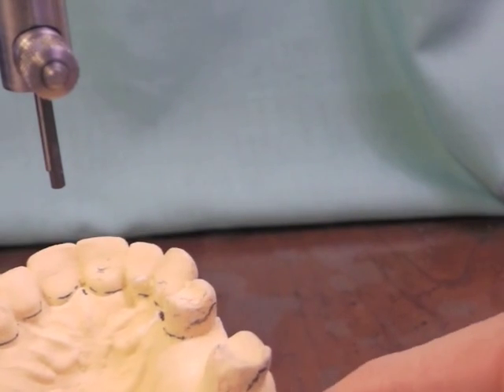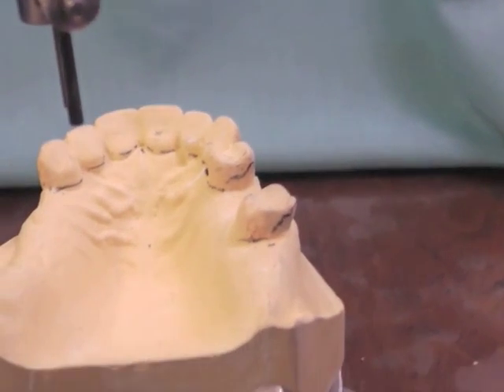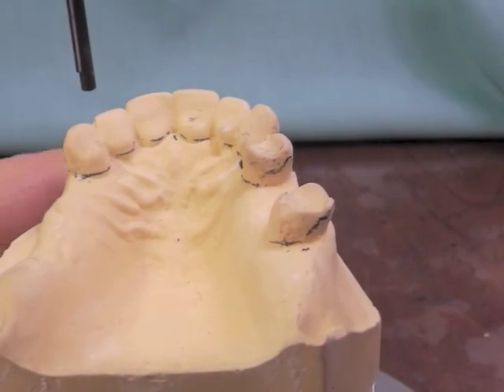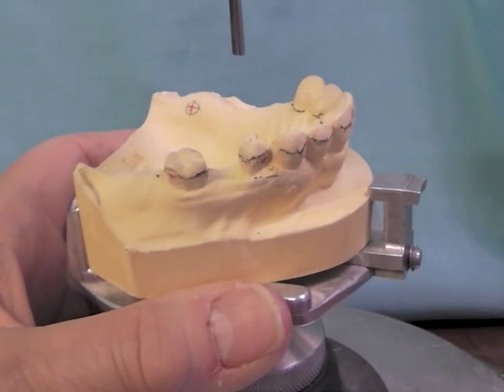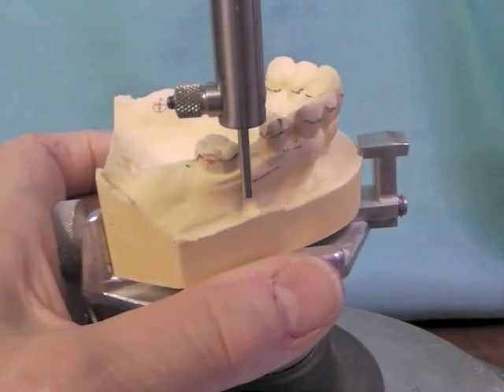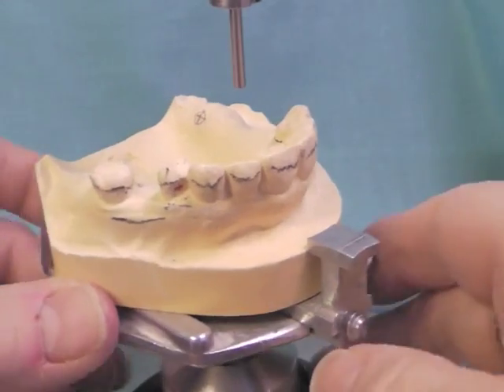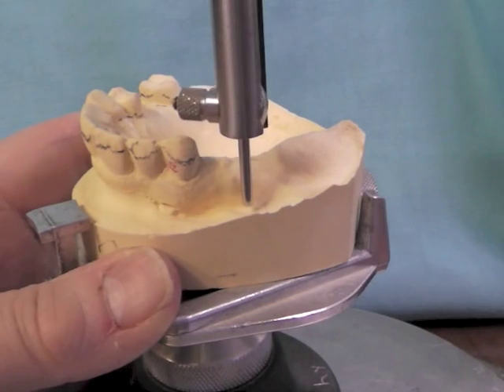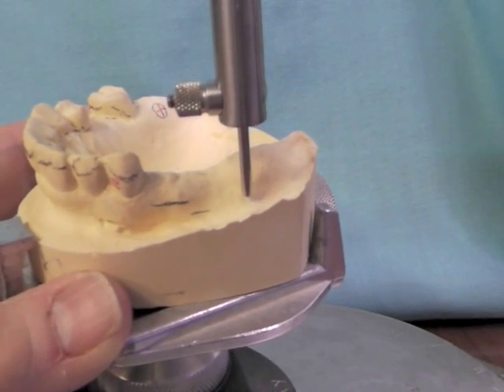These teeth, as typical with maxillary teeth, tend to lean toward the buccal surfaces. The mandibular teeth tend to lean a little bit to the lingual. We can also mark the bony undercuts because we know our flange really can't go below that point on the side, or it will be sticking out away from the tissues. So we would mark any bony undercuts.